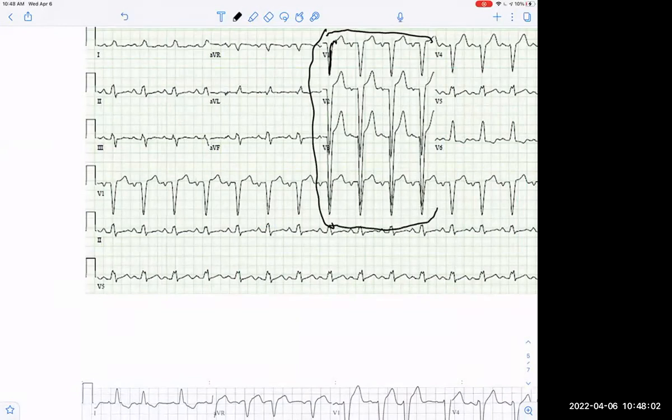That's the elevations. Is that left ventricular hypertrophy? Yeah, absolutely. You would expect to see ST segment elevation in this EKG because there is a left bundle branch block. In order to differentiate whether we actually have a STEMI going on, we're going to use Sgarbossa criteria, which we're going to discuss after lunch.